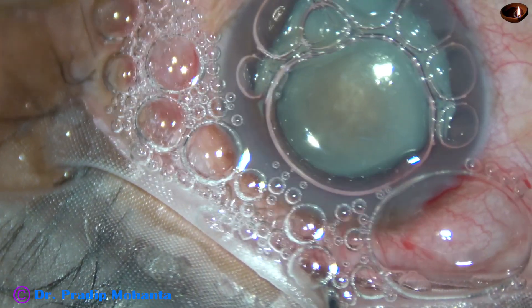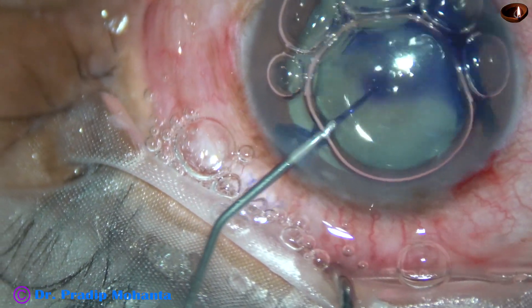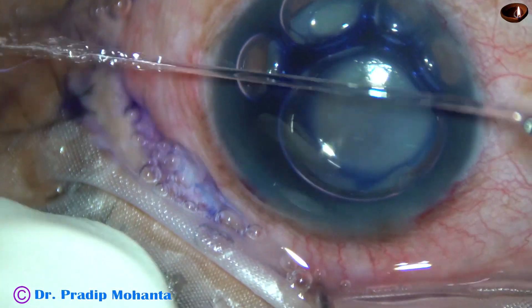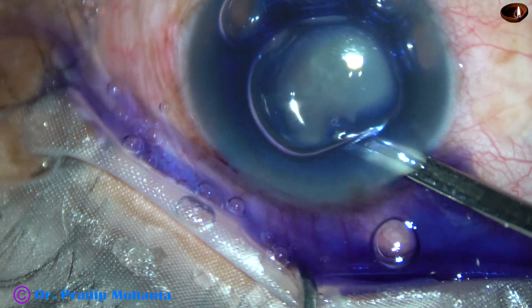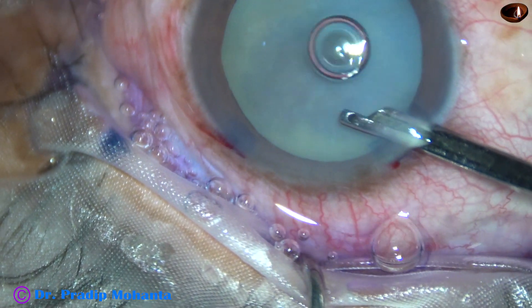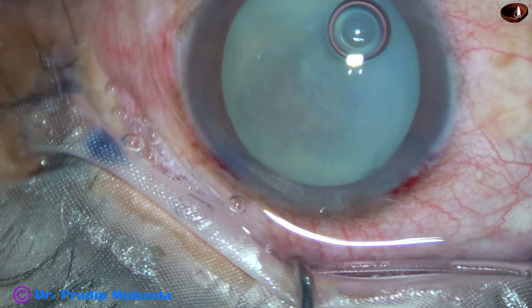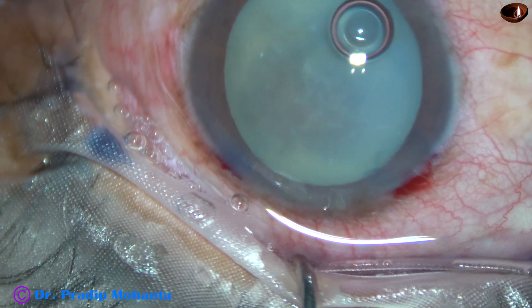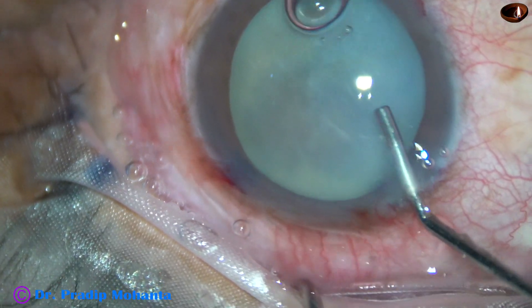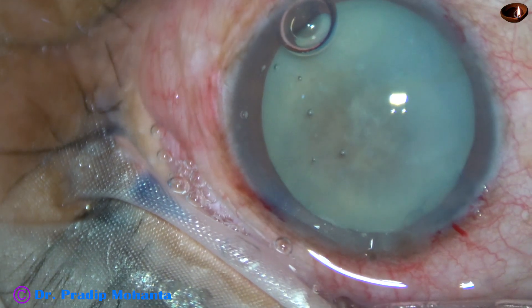An air bubble is used to fill the anterior chamber. Underneath this air bubble, trypan blue dye is applied over the anterior capsule. The dye is then washed out, and within a few seconds there is fair staining of the anterior capsule. Now 2% hydroxypropyl methylcellulose is injected to fill the anterior chamber.